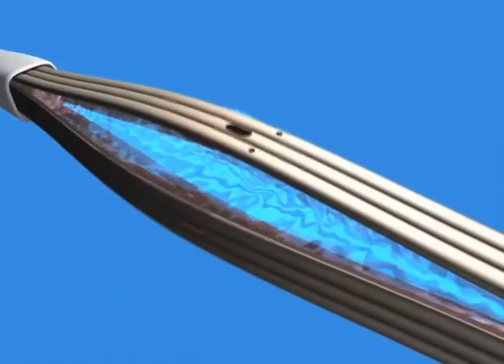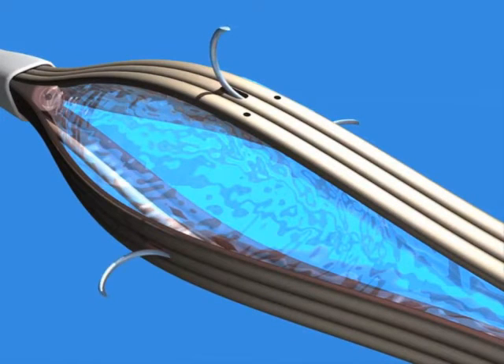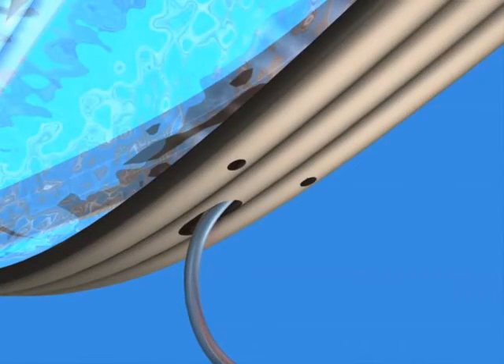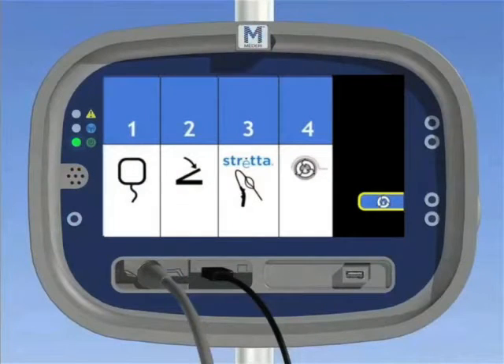11. Inflate the Stretta catheter balloon with 25 ml of air through the PRV. Extend and retract the needles, then inspect needles for full extension and retraction. 12. Push the prime button on the lower right of the generator to initiate priming of the Stretta catheter. Inspect irrigation exit ports and ensure water flows through the device near the base of each needle. Push the prime button again to stop the prime cycle.